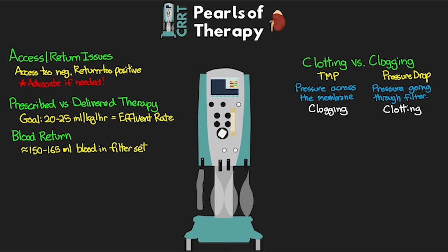Then as we go through the process of returning the blood, basically we're going to be filtering this fluid from the access all the way up through the filter and then back through the return line to the patient, really returning a majority of the blood to the patient. Of course, it's important that we're closely monitoring during this time for any clots or how the patient is really tolerating this.